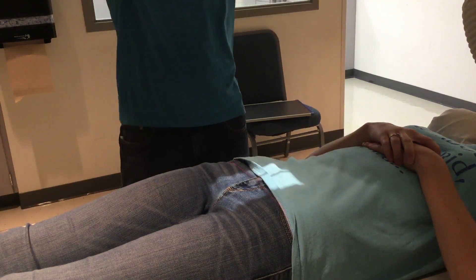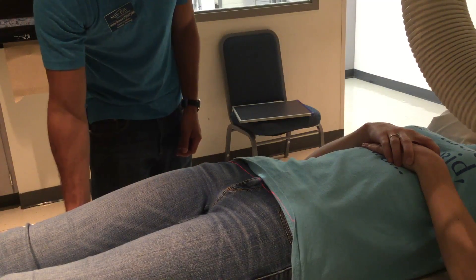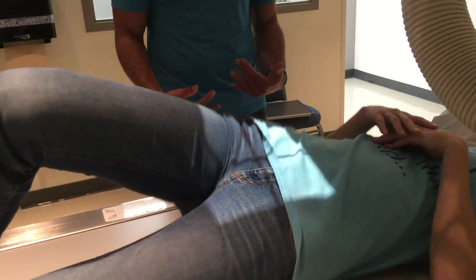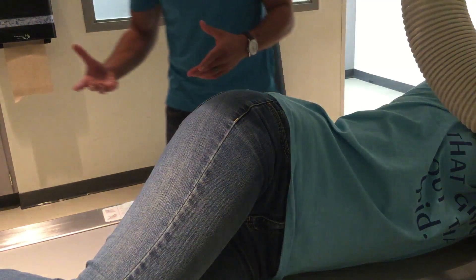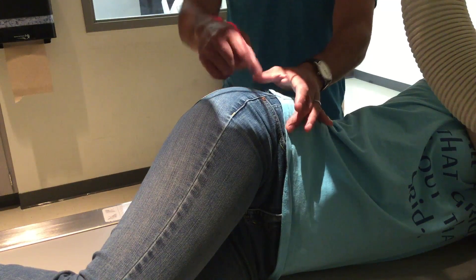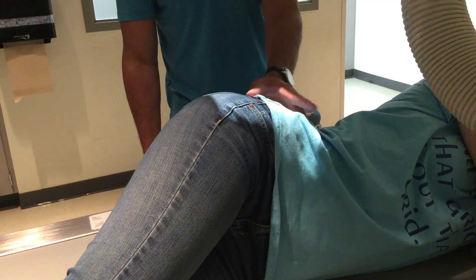So now for the lateral, you take the angle off — straight lateral. I'm going to have you roll all the way on your side again. Stack your arms together if you would. You just want to get the pelvis nice and square, the hips even, because you want it all superimposed. For this one you are two inches posterior to the ASIS and then about three inches down from the crest.